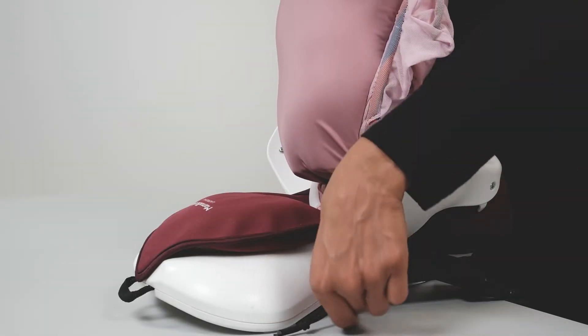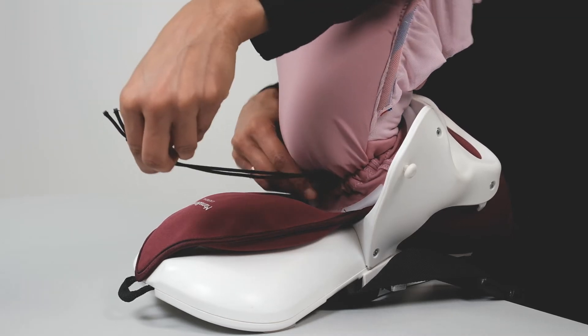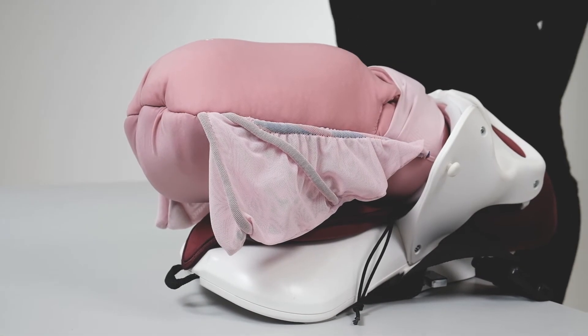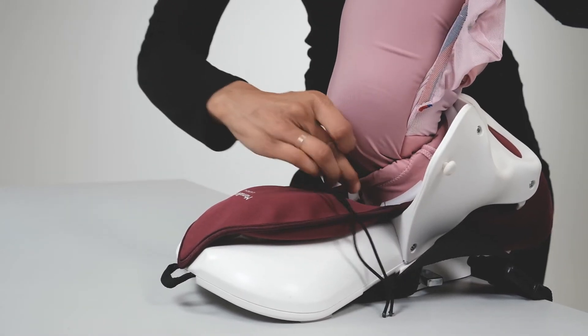Lift the uterus to see the cervix drawstring. Tighten the drawstring to position Baby Berthy's head at the pelvic brim. To simulate an impacted head, open the drawstring and position Baby Berthy's head further down in the birth canal.